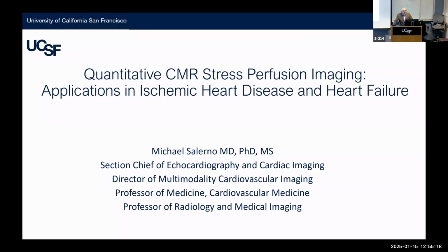Another really interesting area for this is low field. We have a low field scanner here, so much less susceptible to metal artifacts, an area that we'll be interested in exploring to see if you can do perfusion and other things on these machines.